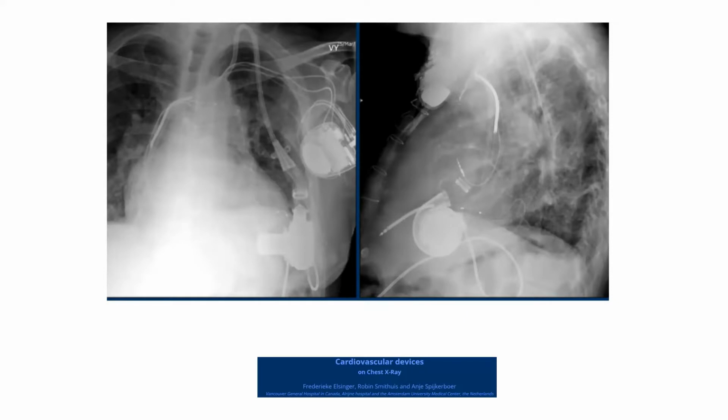You see, this cannula is inserted into the LV and it takes blood. It sucks the blood from the LV. It goes into a pump, okay? And through a cannula into the proximal ascending aorta. You see? So this is LVAD, left ventricular assist device. Okay, you are so right.